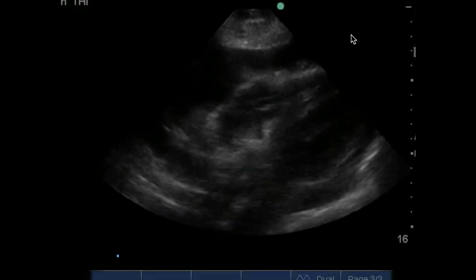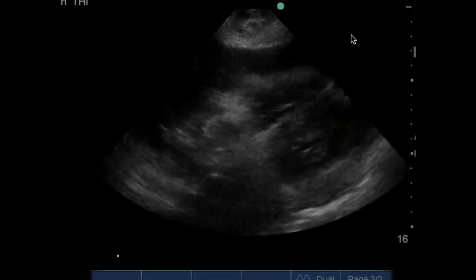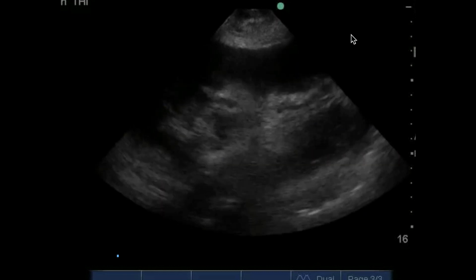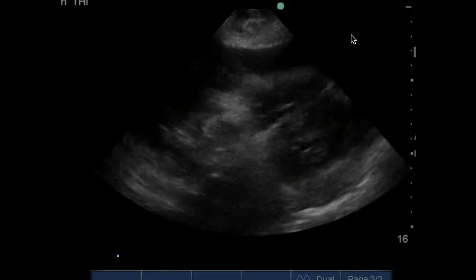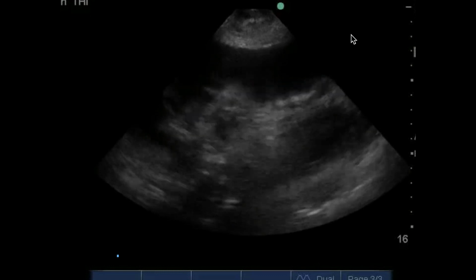So I told the dad, I say, hey, listen, actually this is not a blood clot. Now that I'm looking at this with ultrasound, I was wrong. I'm a little embarrassed. This is actually pericardial tamponade, and it's actually pretty easy to fix. We just have to take a needle, put it through her chest wall, and draw the fluid out.